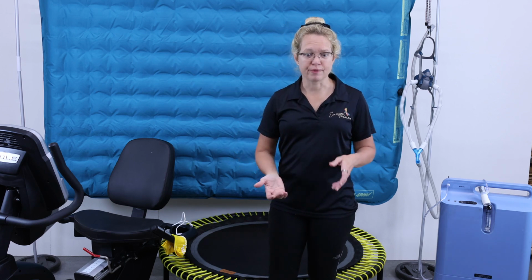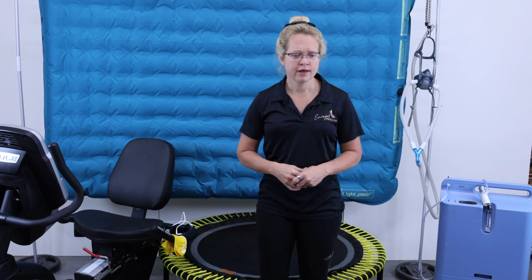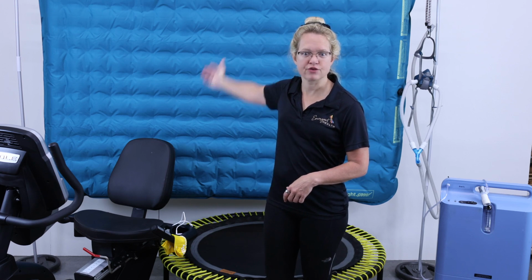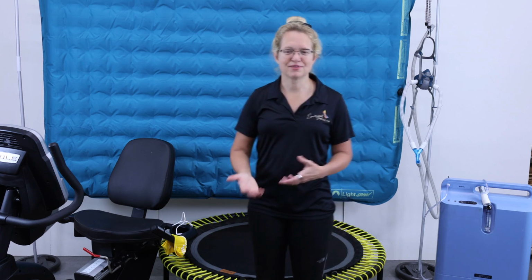The oxygen reservoir bags are typically very expensive, several $100s. I think the cheapest I've seen is $300, but this mattress was only $40 to $45. So you can get the same thing if you're just creative about what you use for your bag.